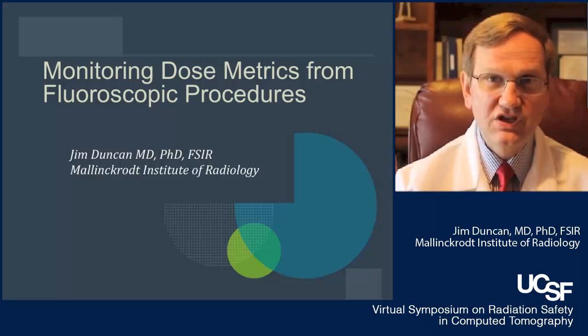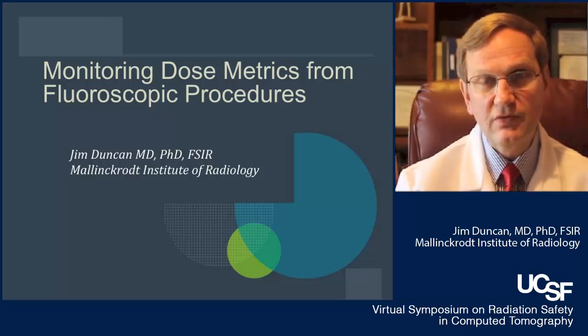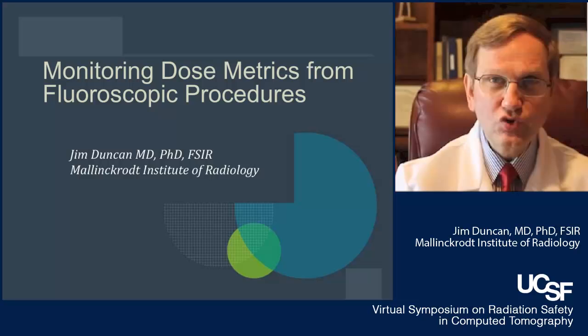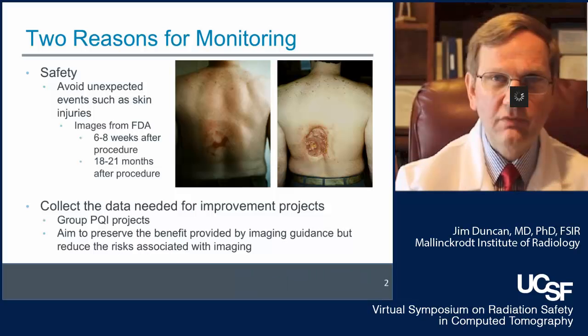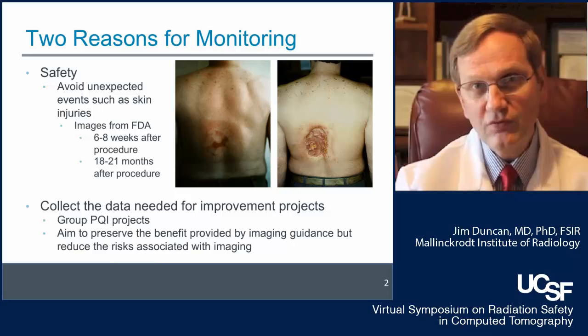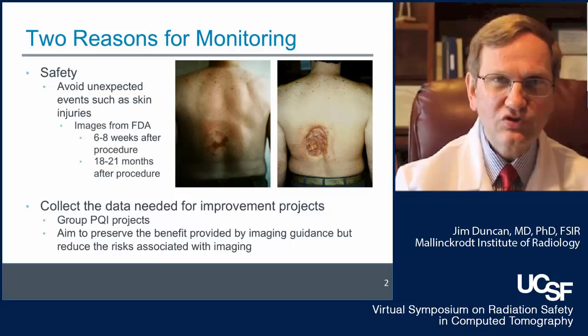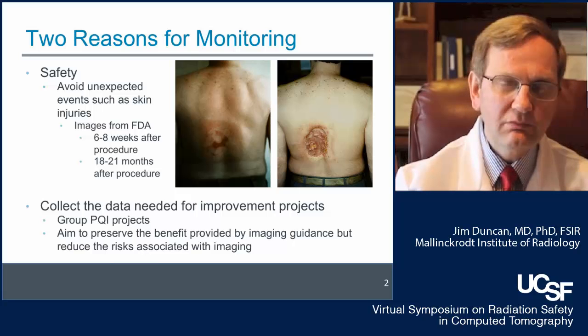This presentation is on monitoring dose metrics from your fluoroscopic procedures. There are two reasons to monitor. The first is safety, that you want to avoid exposing patients to a substantial radiation dose, but it took many months for the extent of injury to fully manifest.